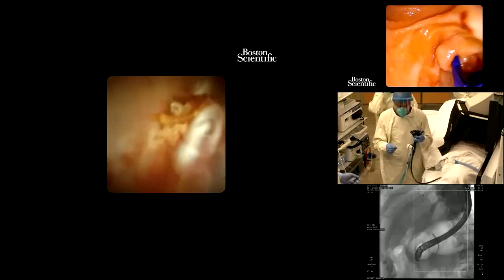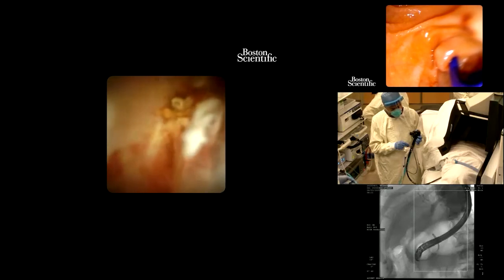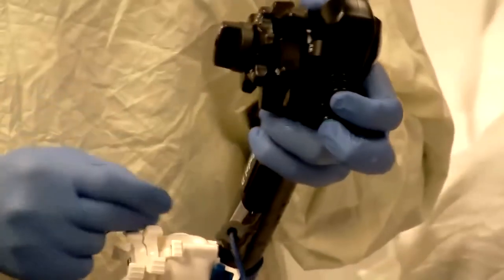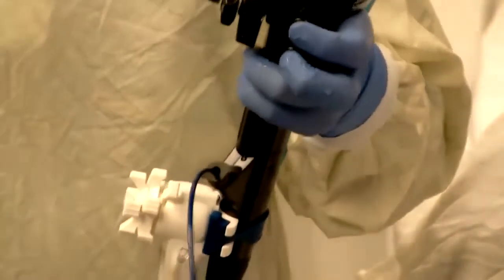Stephen, can we zoom in on Dr. V's SpyBite Max forceps? Open, Enrique. Yeah, there we go, with the camera. It could be a little difficult to see because it's very, very small. But staying just a few feet away from it, I can see the serrated margin and then the wide margin. It's almost like a pediatric biopsy forceps. So let's close.